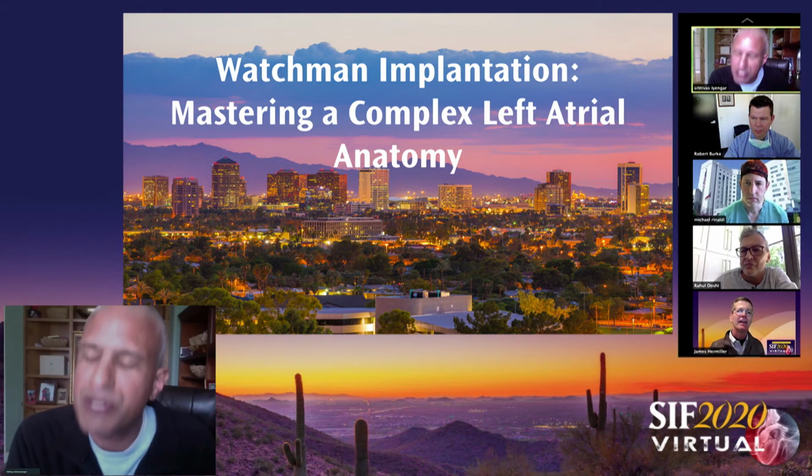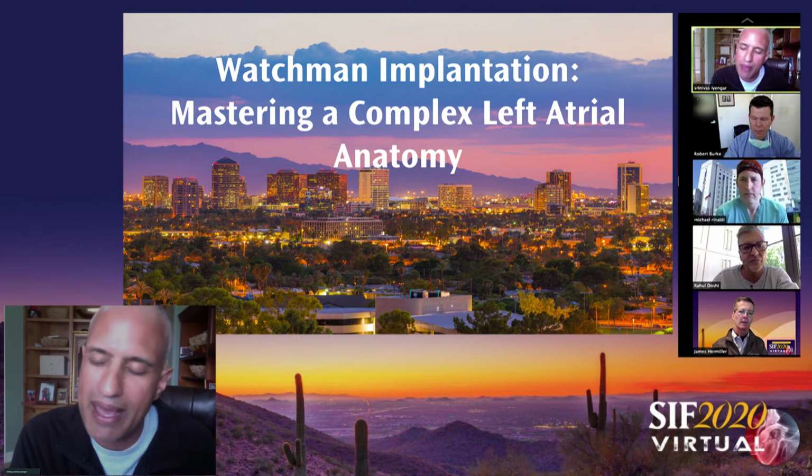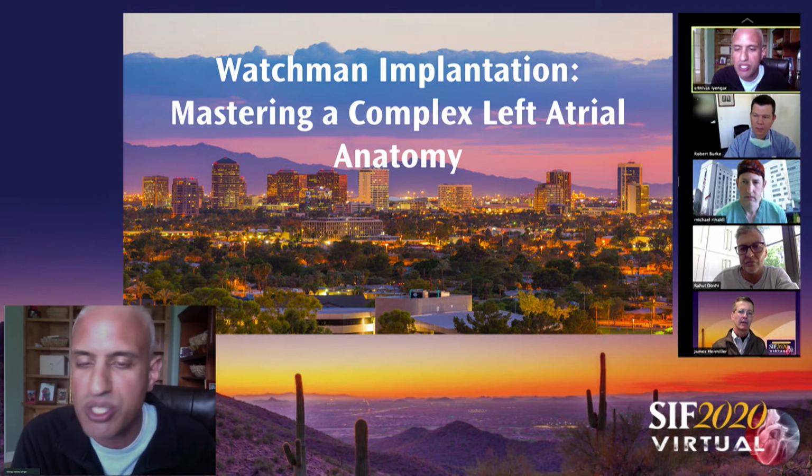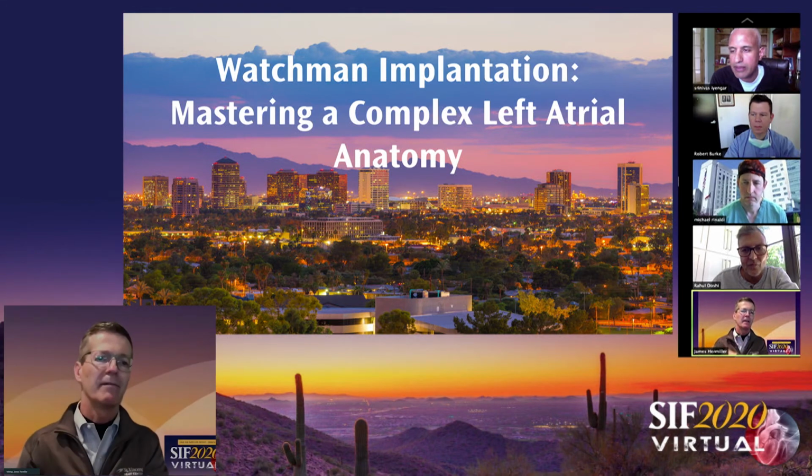It fell posteriorly, and I believe, just like it was discussed about the less torque. Some sites I've actually seen try to do a 2-man deployment on this. I do a 1-man deployment, so I had to have full control of the device. So I just took the risk of pulling it back during deployment, and it fell into the ostium very nicely. Yeah, that's beautiful. Mike, what do you think?